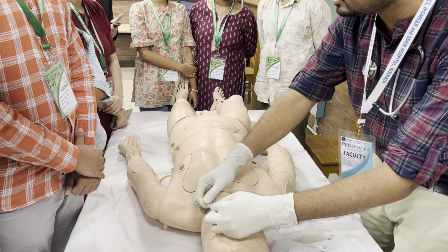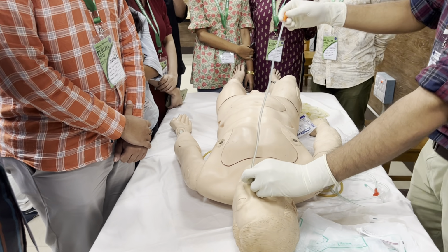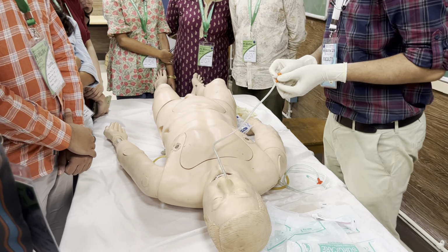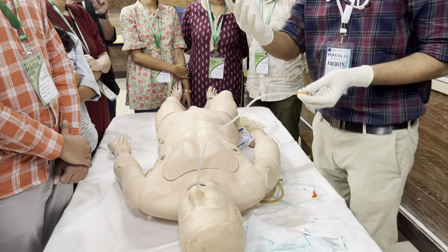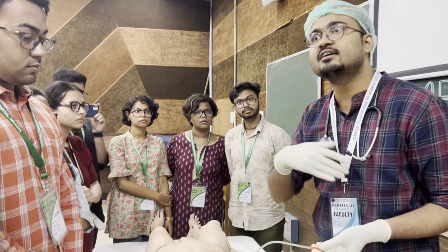This is the second line. As you can see, I have introduced the tube up to the second part. This part is remaining. Now what you have to do is confirm whether it is in the food passage or respiratory tract. If it is in the respiratory tract, the patient will cough it out. Like there will be a vigorous cough, right?